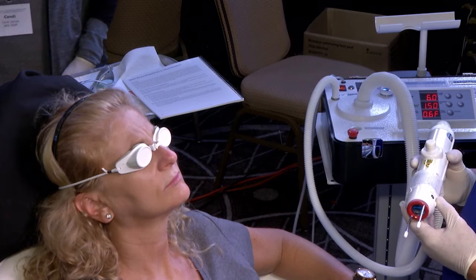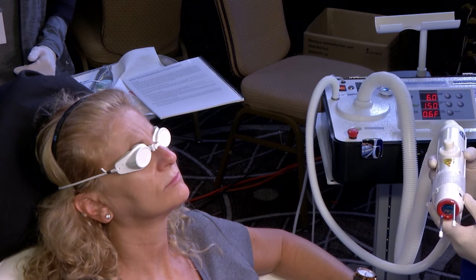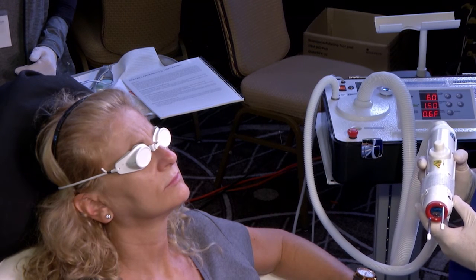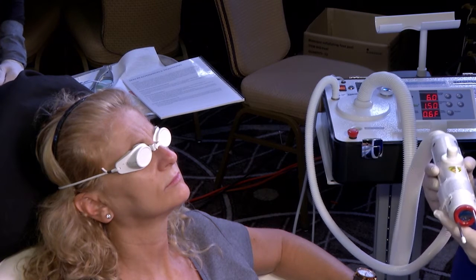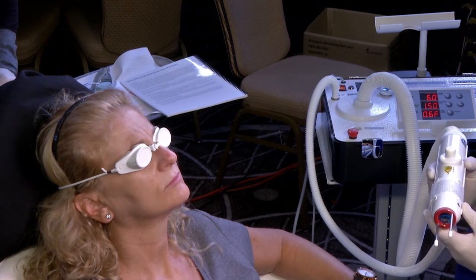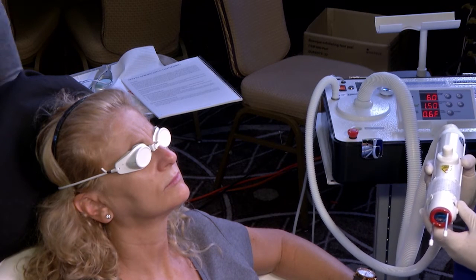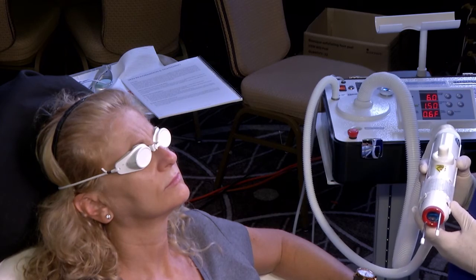Any more questions before we go on to our next treatment? The question is about packaging peels with this treatment or PRP. Both can be done with this. I generally do the laser treatment first, because that gives me the depth I want. Then I'll do a peel — if I do the peel first, the energy from the wavelength will be blocked by whatever action the peel does. PRP could technically be done before or after, but generally I do everything after the laser treatment. There's absolutely no reason not to do them at the same time, and we do it all the time.